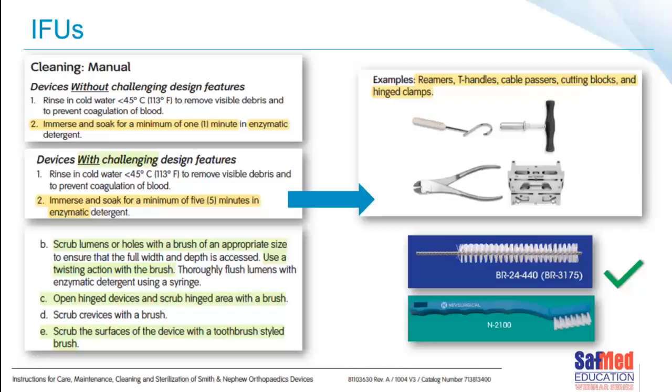So not only are they telling you to use a brush, but they're also describing how you need to use the brush. Open hinge devices and scrub the hinge area with a brush. Scrub the crevices, scrub the surfaces of the device with a toothbrush-styled brush. Not a tooth, a toothbrush-styled brush. So, an incredibly clear set of instructions about what you should be using and what you shouldn't be using. So very important, please, to follow the manufacturer's instructions.